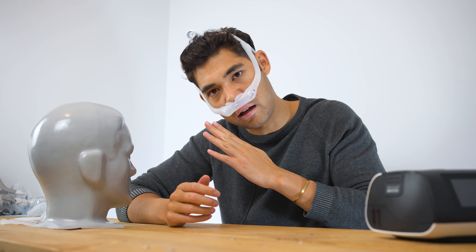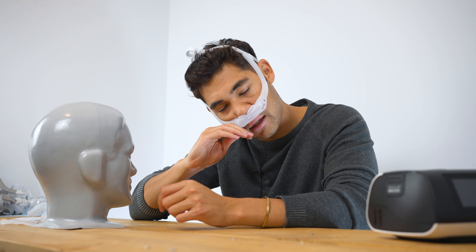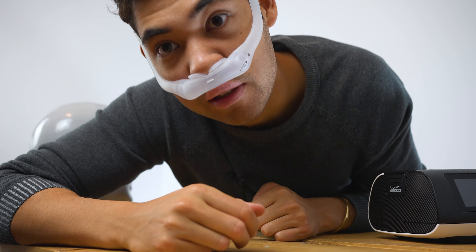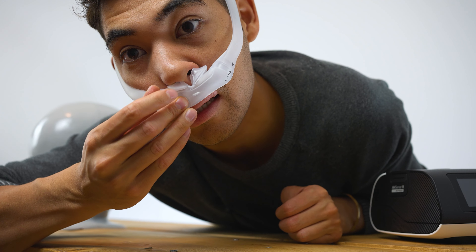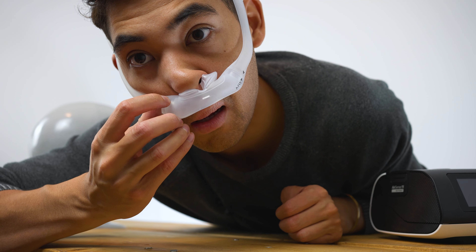The rest of the mask is pretty decent. I do like the Dreamwear masks in general — they're nice, lightweight, and very comfortable. A lot of people use them; they're a very popular mask. But in my opinion, the pillow version isn't the best.